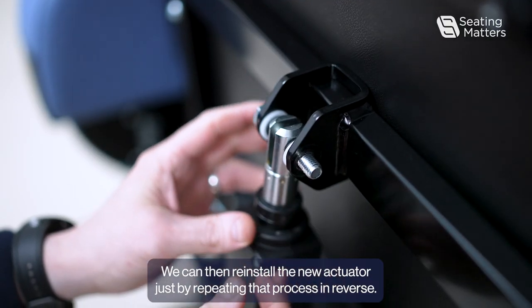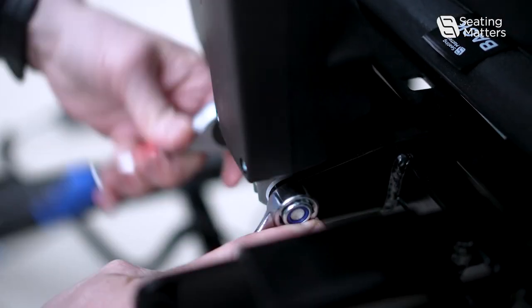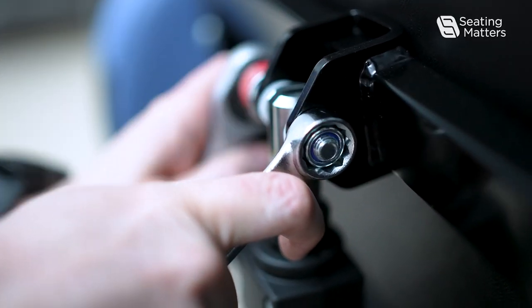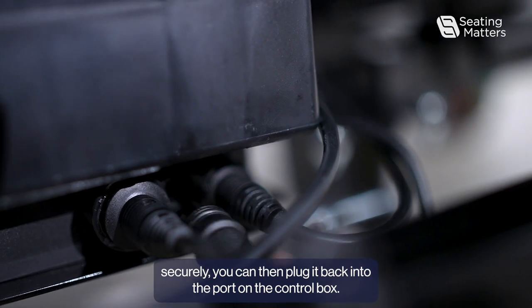We can then reinstall the new actuator just by repeating that process in reverse. Once the actuator has been fitted securely, you can then plug it back into the port on the control box.